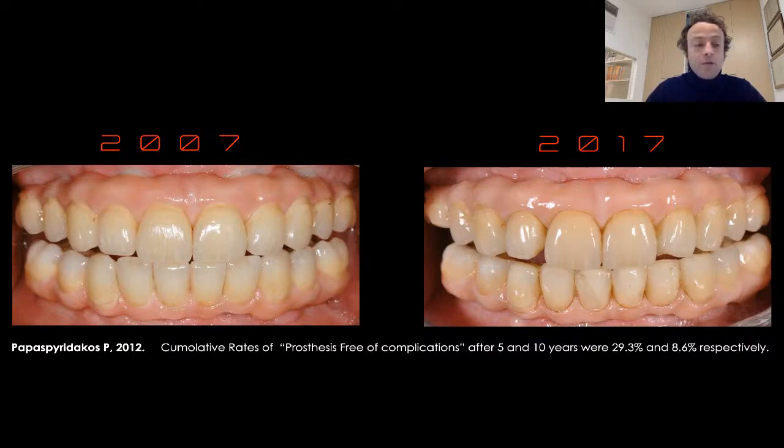It's a good patient, a wonderful case in terms of implant success, with good bone support and amazing stability of the margins. But in terms of prosthetic success, we can say that absolutely we don't have a good success.